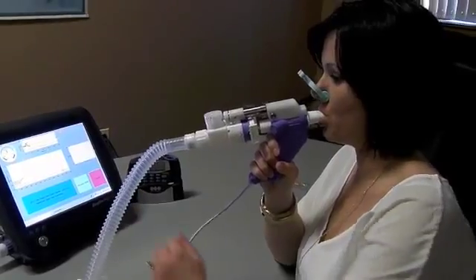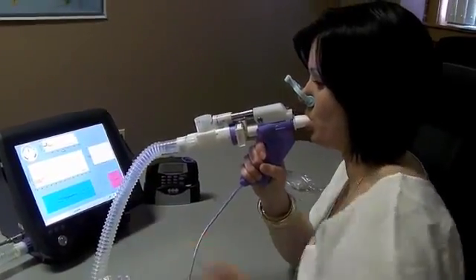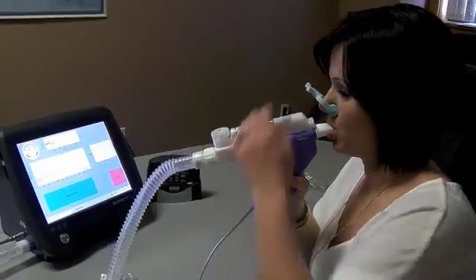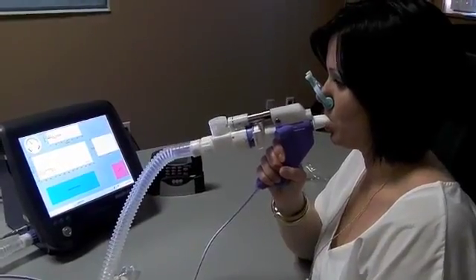And when she starts, we'll activate the test, and now the machine is set. After five tidal breaths, it will start nitrogen washout.